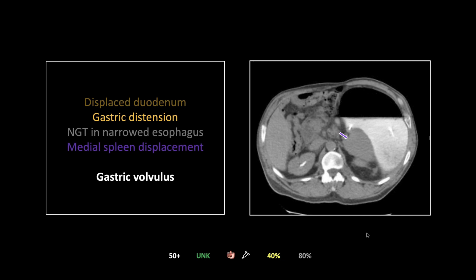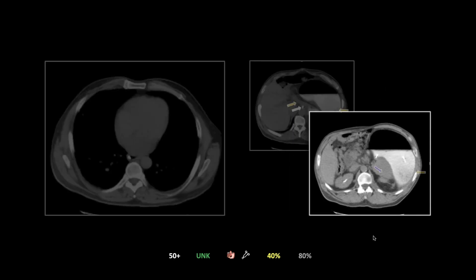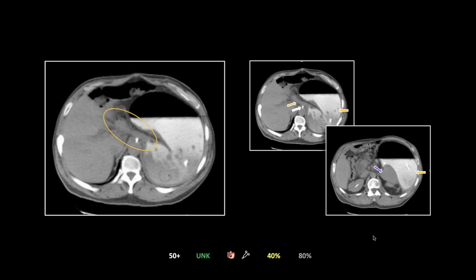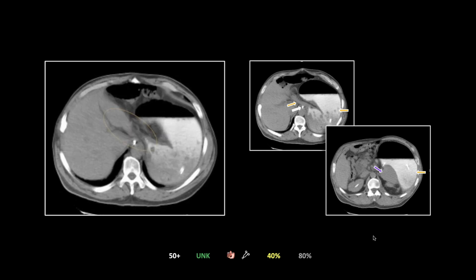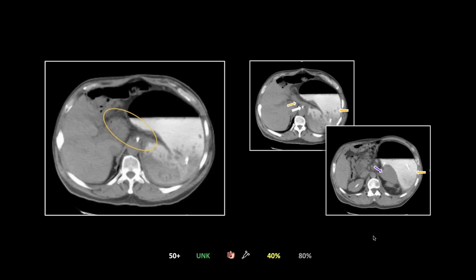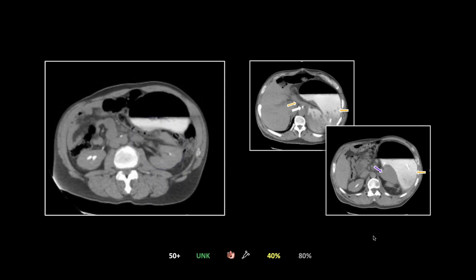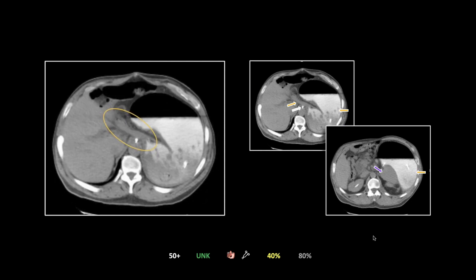Note the marked gastric distension, and also medial displacement of the spleen — one of our radiologists called it the 'wandering spleen,' a poetic name, though it's not specific for gastric volvulus. The gastrosplenic ligament, a band of peritoneum, drags the spleen along with the stomach wherever it goes. The key finding I hang my hat on is the GE junction lying below, or inferior to, the duodenum.